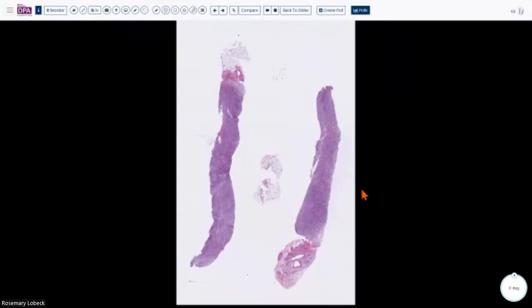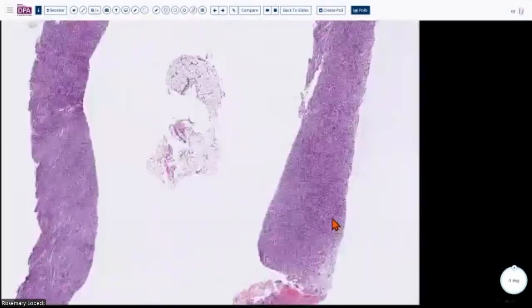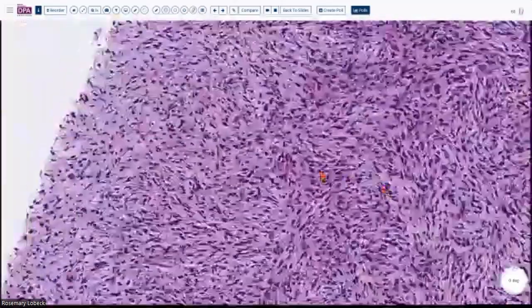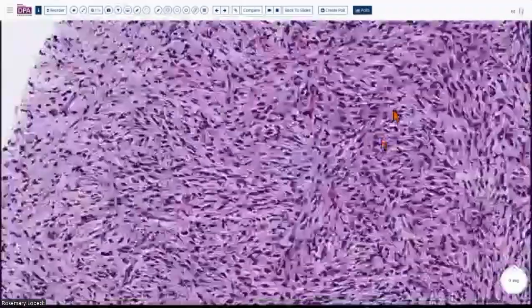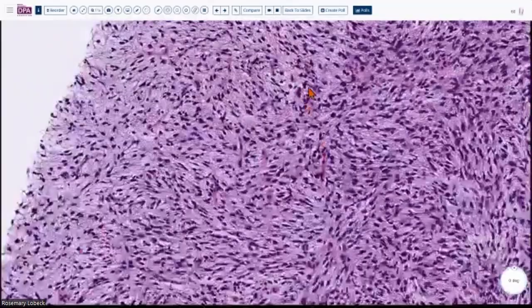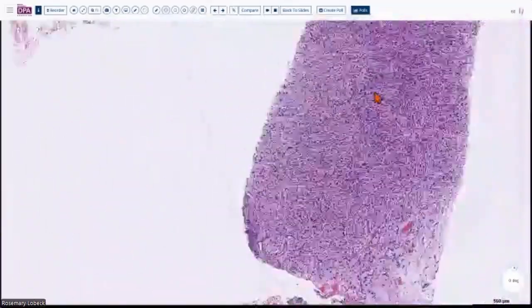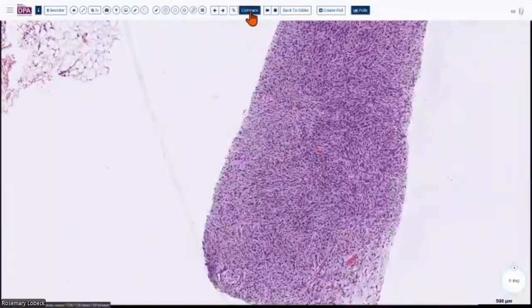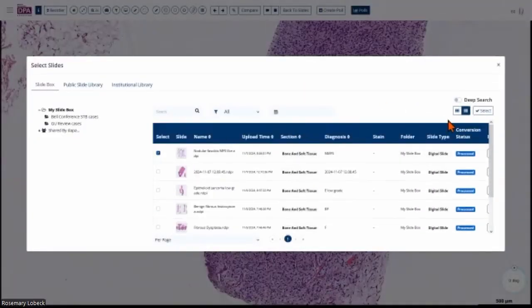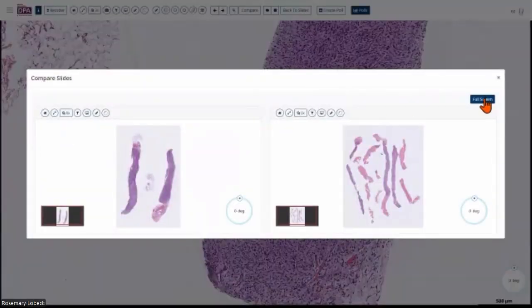So if you look at this mass from a low power, this and the nodular fasciitis look pretty much similar, right? But when you go higher, you will see that there are these larger caliber blood vessels. So if you do the CD34 or CD31, this will pop out, but you can see these are larger caliber blood vessels, and they have this very hyperchromatic nuclei. So again, I'm gonna do my same trick. I'm gonna pull this up and then compare it with your nodular fasciitis. Most of you know what we're going to see here.